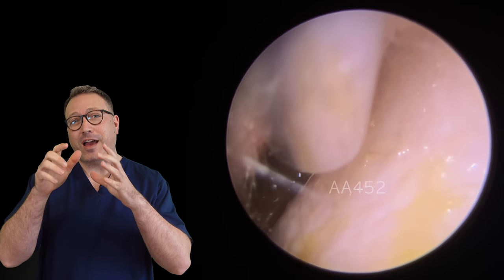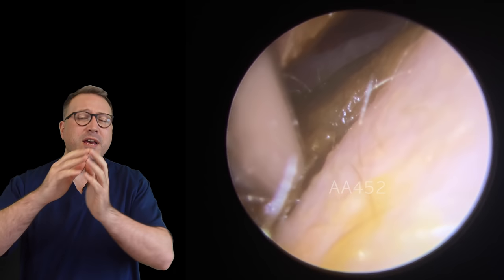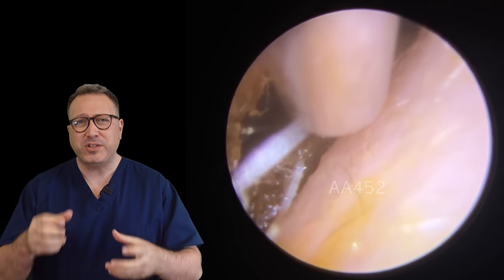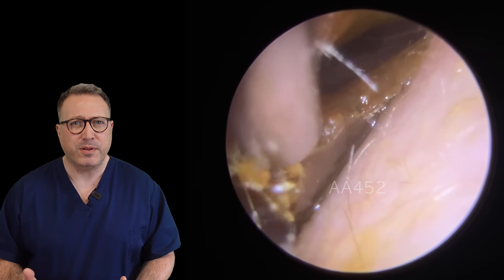You can see with this first patient the ear canal itself, rather than being a round shape, is more of an oval shape and slightly twisted off to one side. This patient hasn't really been feeling any hearing loss, just an irritated feeling inside the ear or something squishing there, and when laying on their ear at night they're feeling quite blocked up when they get up in the morning.